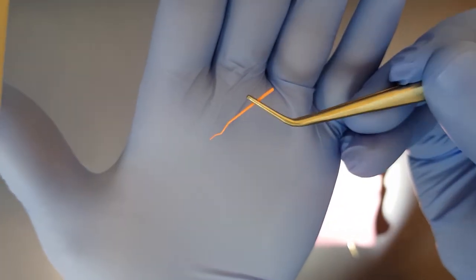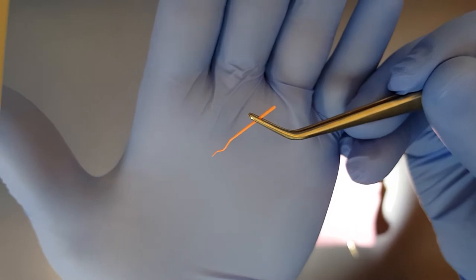So this first tip actually blew my mind when I was first introduced to it by an endodontist. In my opinion the most difficult part of an obturation with cold lateral condensation is getting all the accessory points in. They're so thin and flimsy that every time I try to put them in the canals they either crumple up or they don't go down as far as I want them to.